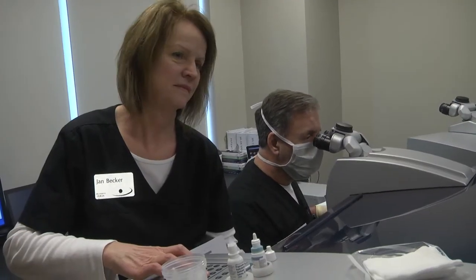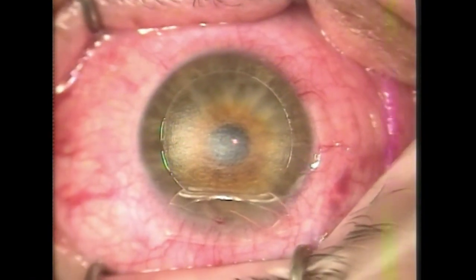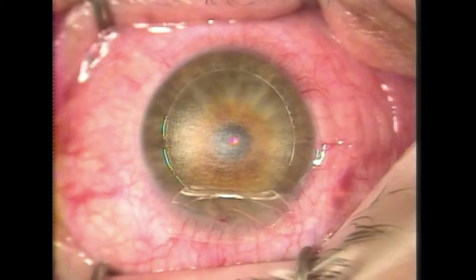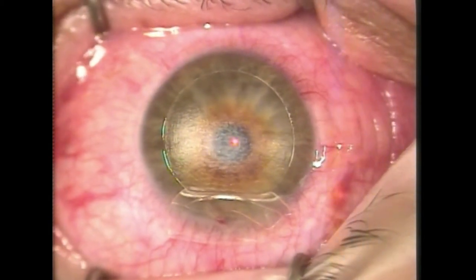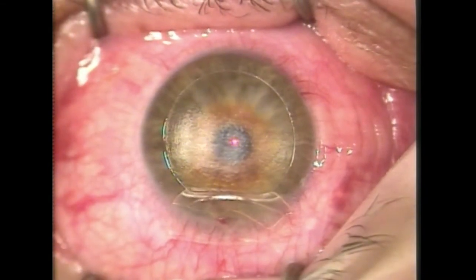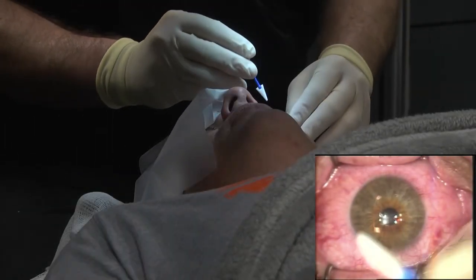Now I'm going to have you look right at that green light. You're doing absolutely perfect. Don't worry about the noise, just keep looking at the green light. You are doing so perfect, absolutely perfect. Smoothing the flap into perfect position.